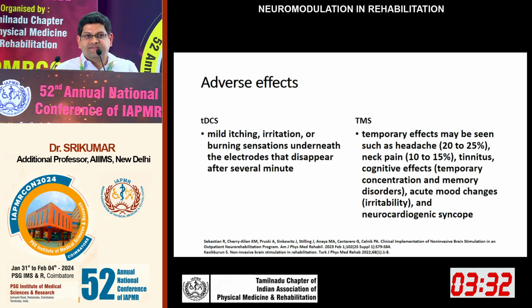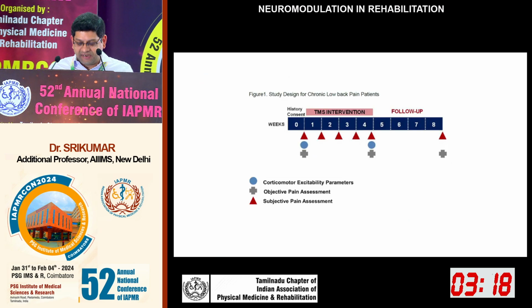Are there any adverse effects? The adverse effects are mostly minimal and also temporary. In direct current stimulation, as expected, some itching and irritation is seen, whereas in the TMS, it's mostly headache, neck pain, cognitive effects, etc. But no significant seizures have been reported.